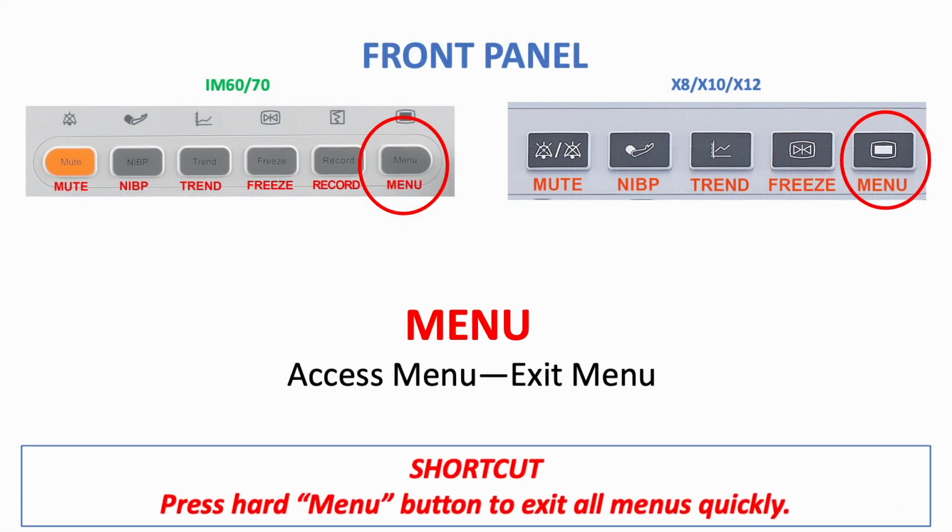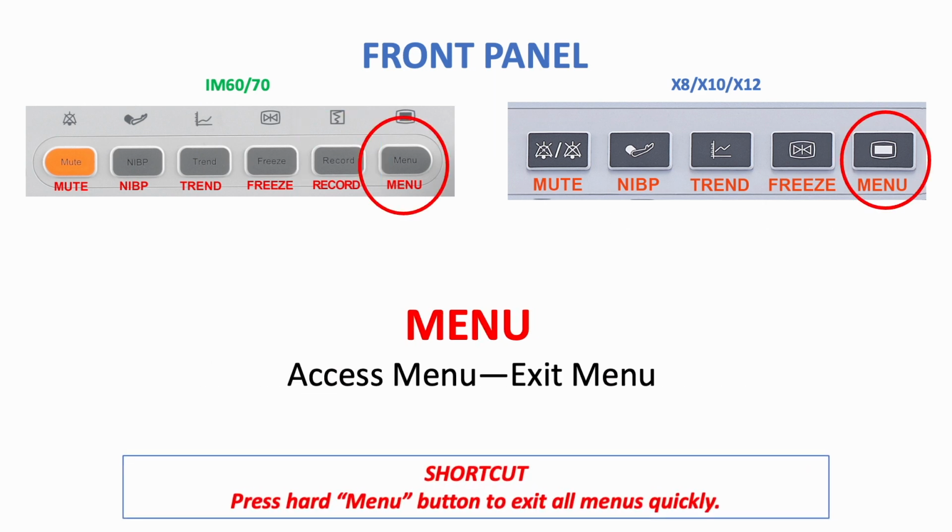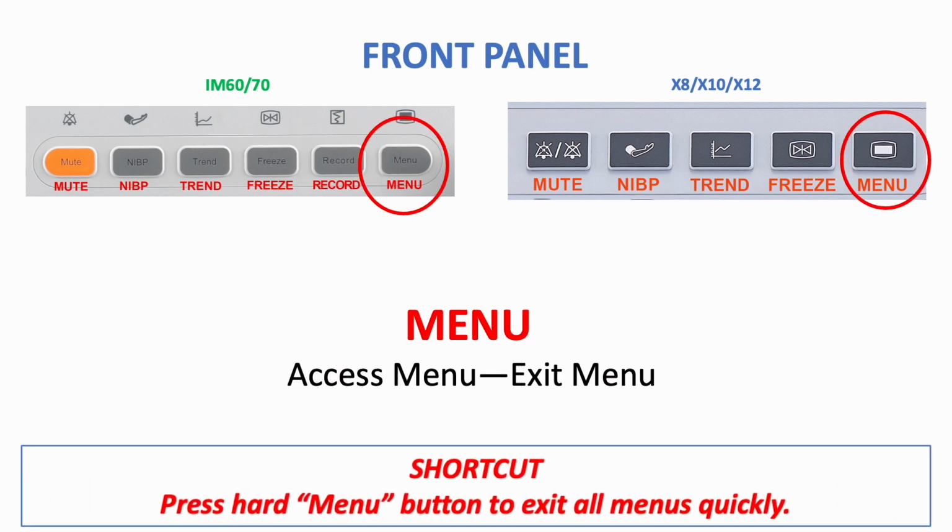Finally, we have the menu button. This button is used to access the menu screen and also as a shortcut to exit all menus. Press the hard menu button to exit all menus quickly.